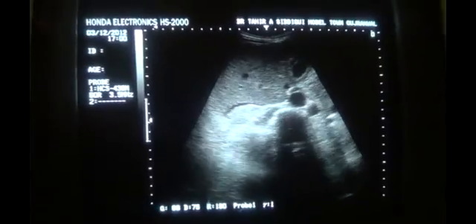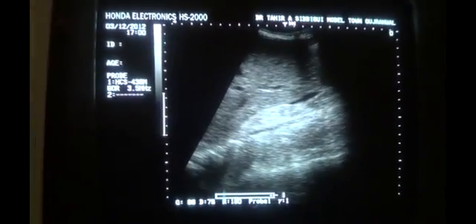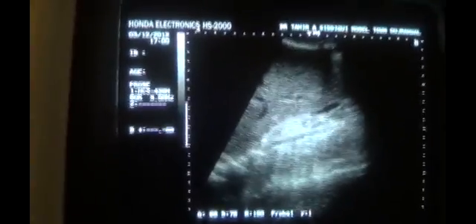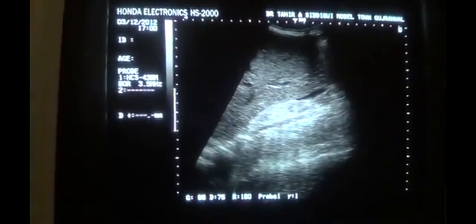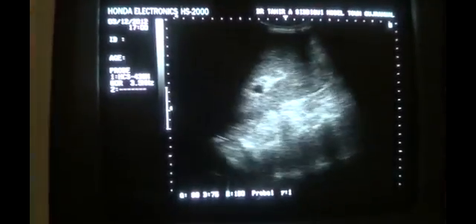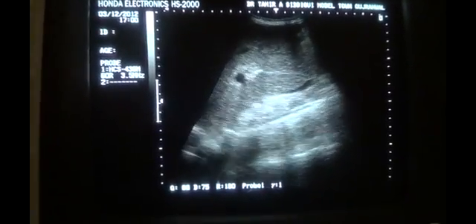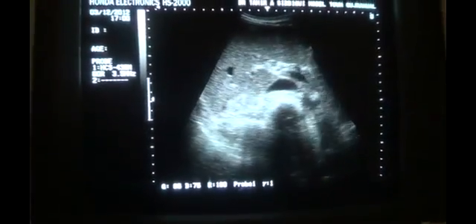And now if we talk about the kidney, it is lost. This is the end stage kidney, fibrosed. So we cannot compare the kidney and the liver in such cases when we are taking the liver span, or the dimensions of the liver. So first thing is that liver is seen below costal margin.